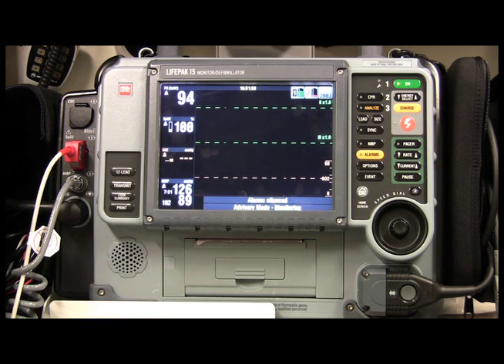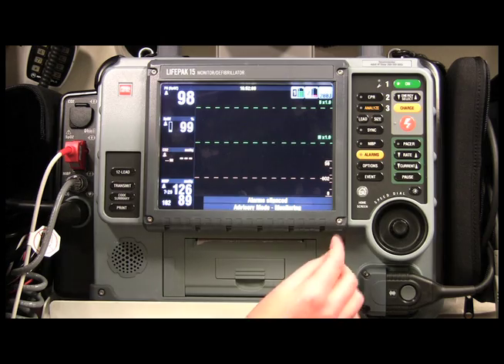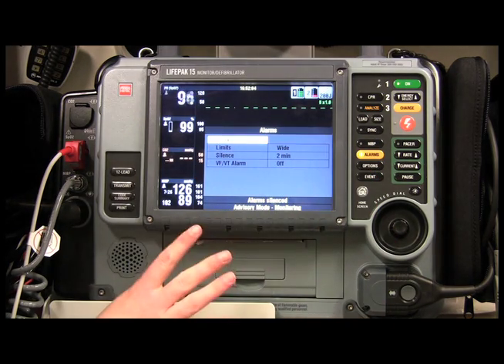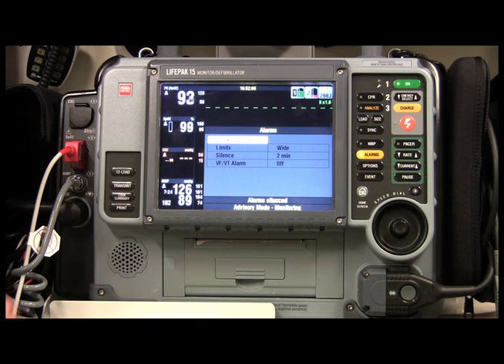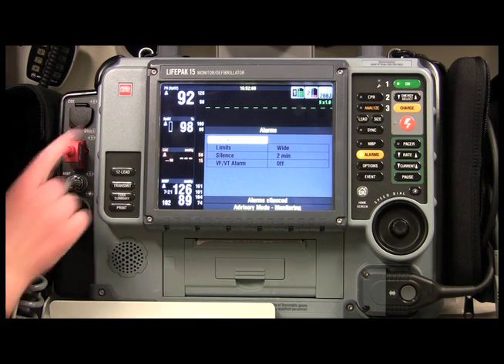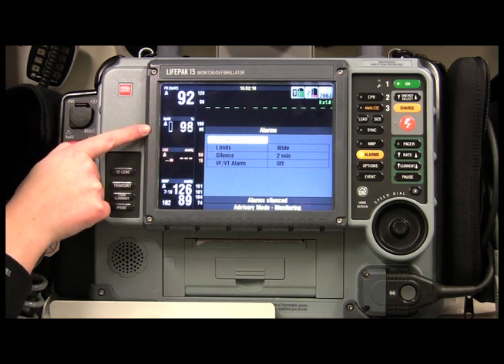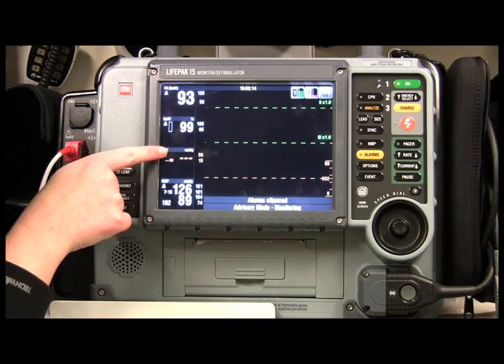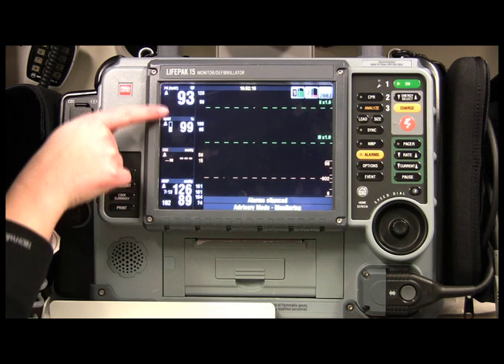One really cool thing I almost skipped over: if you go to Alarms, you can set a whole range of alarm parameters — for pulse rate, SpO2, and others — and you can see what thresholds are currently configured.